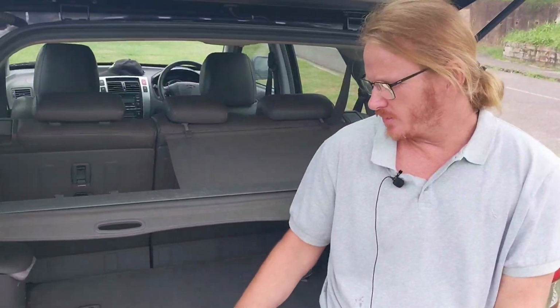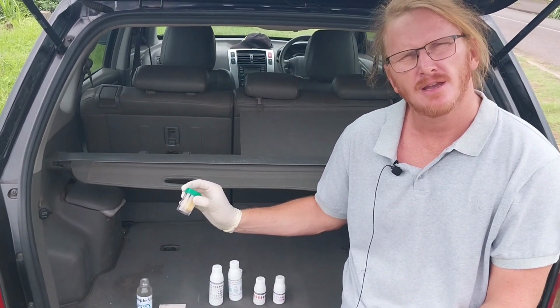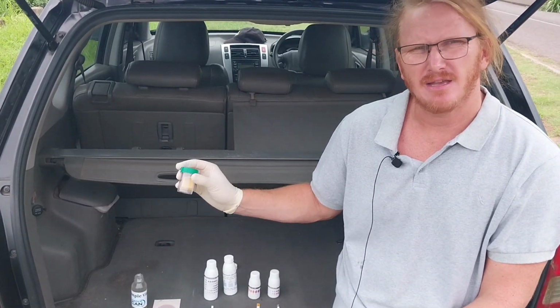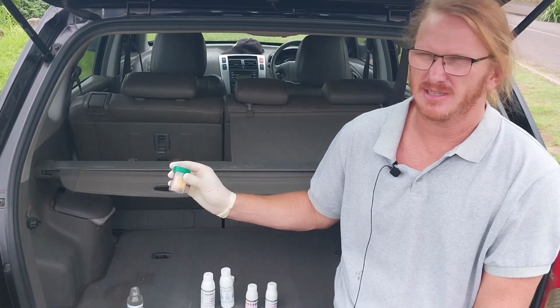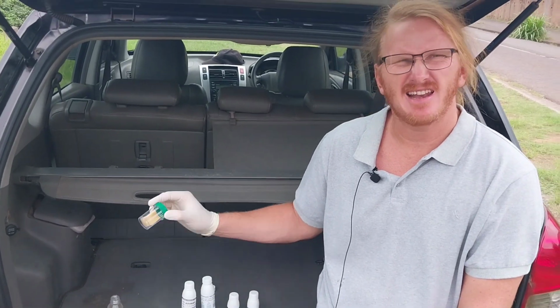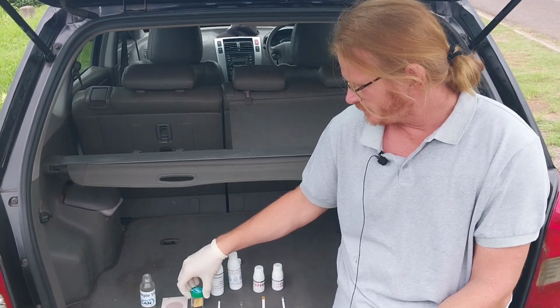All right, so what we're going to do now is we're going to test for the bacterials. So we've got 2 tests for bacterial. We've got the coliform test, which is animal and plant waste that's in the water. This is a true or false kind of test. If the water goes black after 48 to 72 hours, it means there's high levels of coliform, which is explained as animal waste and plant waste. And if it stays clear, of course, then there's none. This is a very good test for drinking water. Like, you shouldn't have any of that in your drinking water.